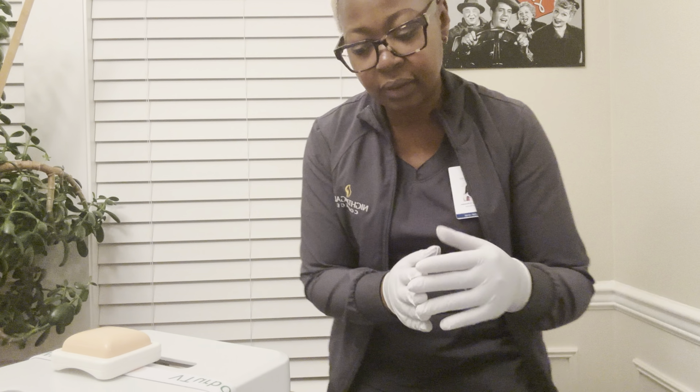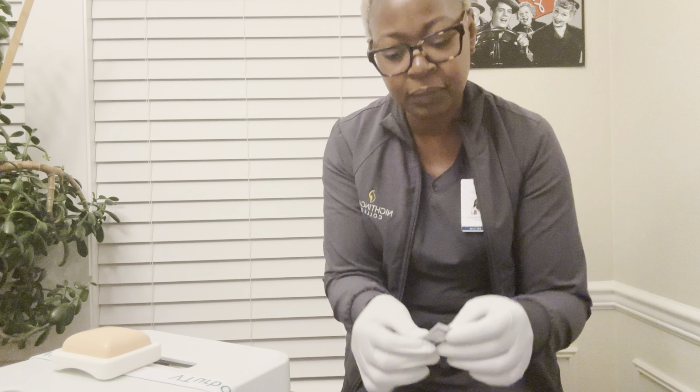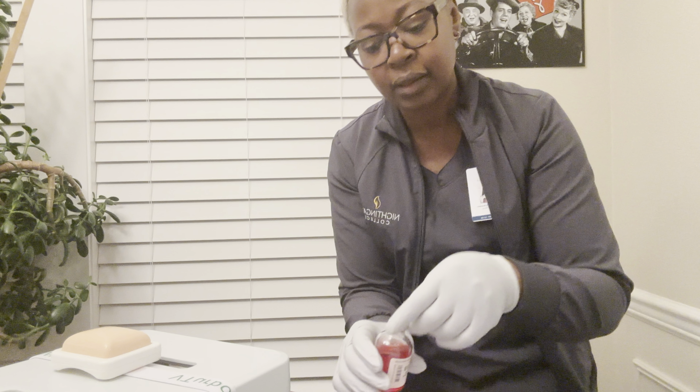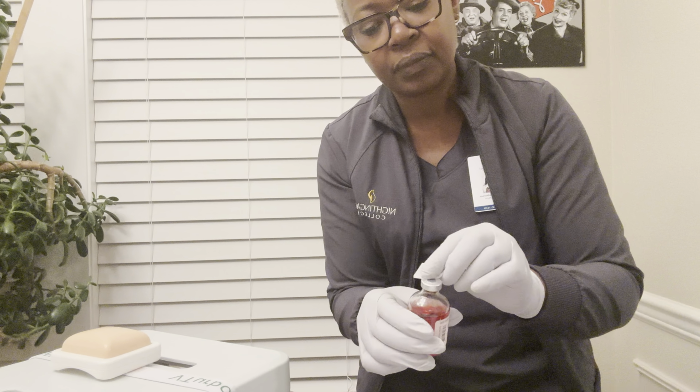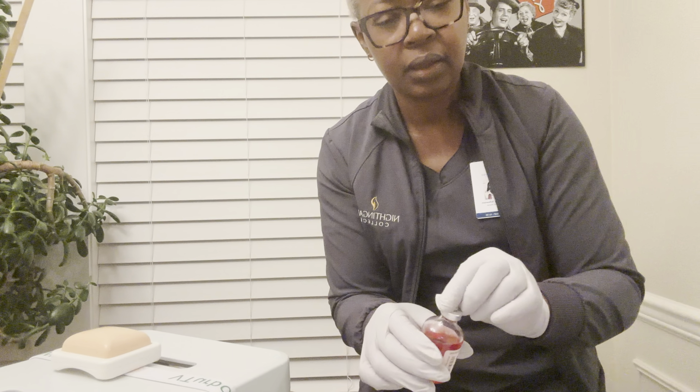So then I'll go ahead and perform hand hygiene, don clean gloves. I'll then go ahead and clean the cap of my medication. I'll do that in circular motions for 30 seconds. And I'll dispose of it in my garbage bin.